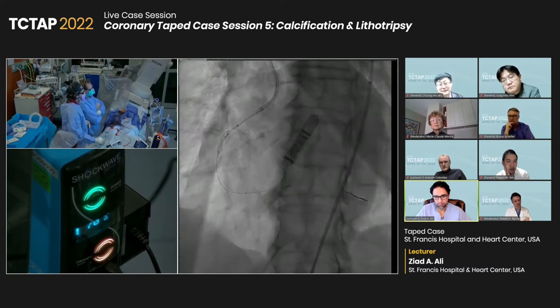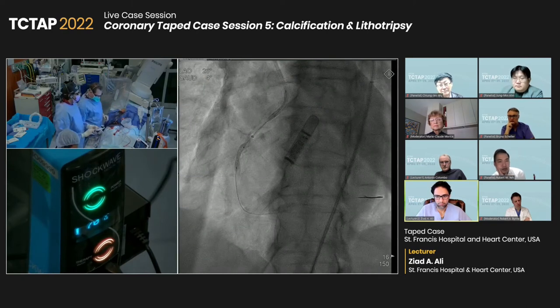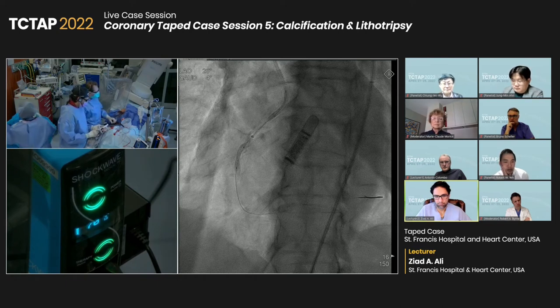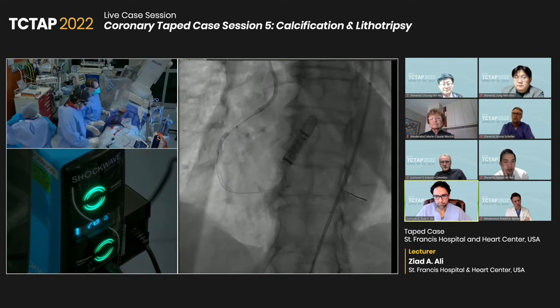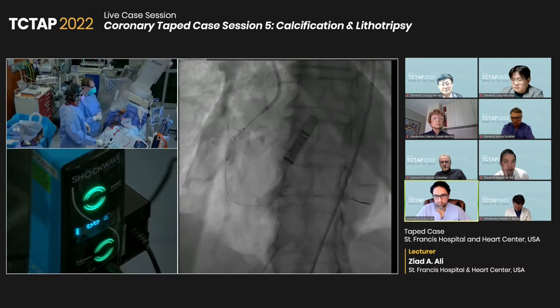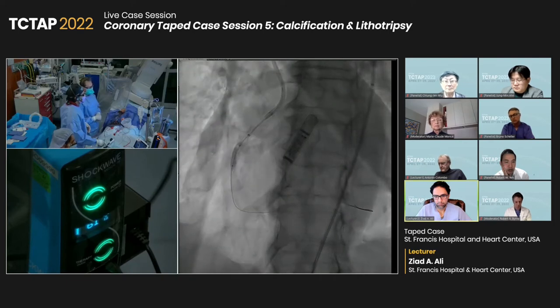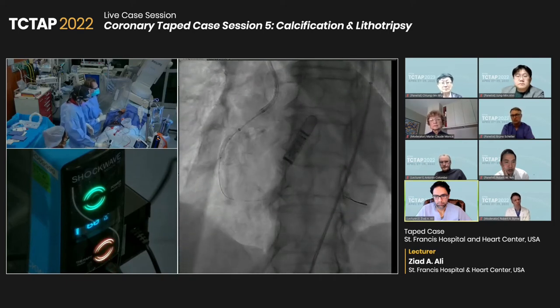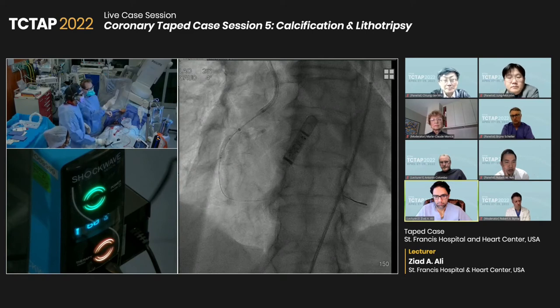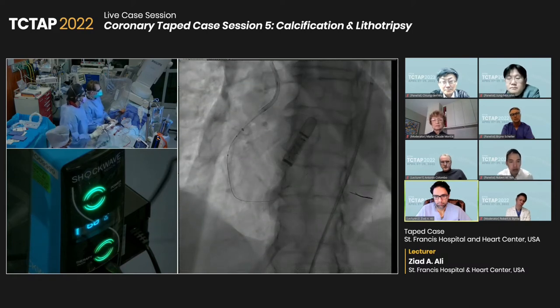What I tried to do was position the proximal emitter right on the lesion. And now I'm going to come back a little bit. Let's do one more here because we have so much space. Usually what I like to do is come back a millimeter or two to have the emitters in different positions within the lesion. But basically, there are two sets of emitters. You see there is a little air in there, which is not ideal. Also, I didn't see the spike on the EKG, which is unusual. Normally you expect to see a spike. Yeah. So, all right, let's try this.